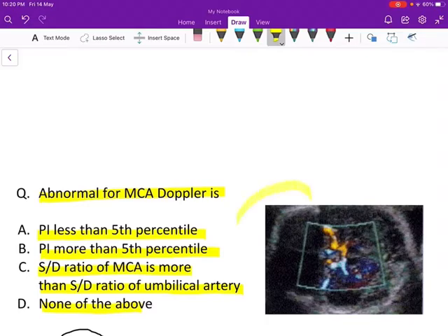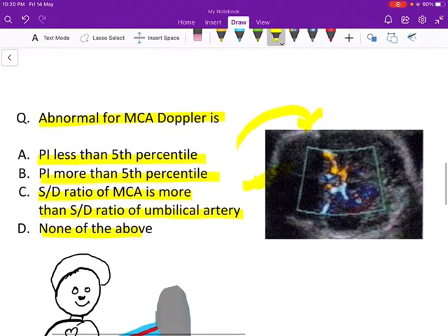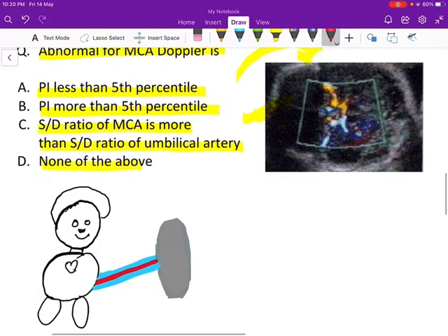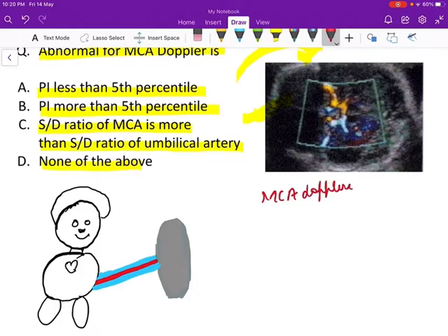This given picture depicts MCA Doppler being performed using the color Doppler and the spectral Doppler pattern. We are going to discuss MCA Doppler today.